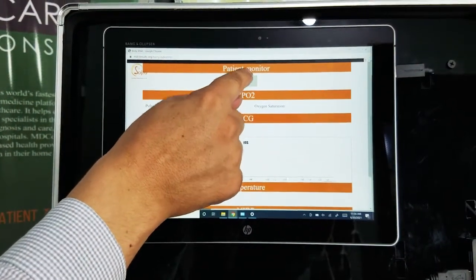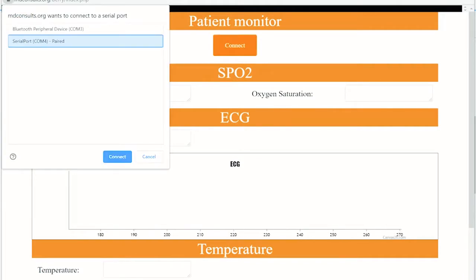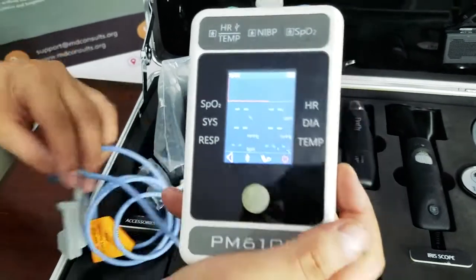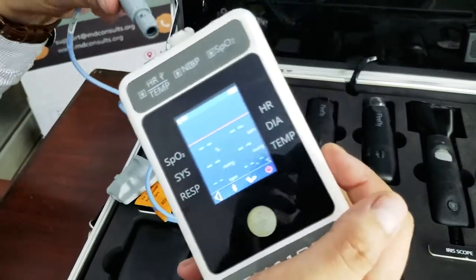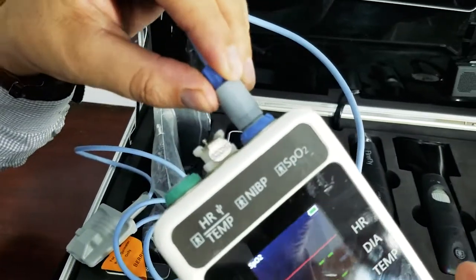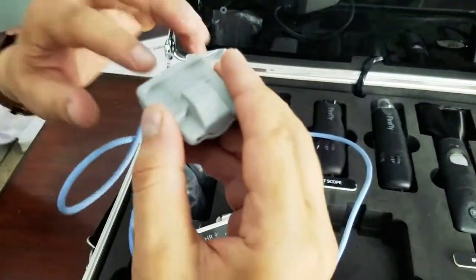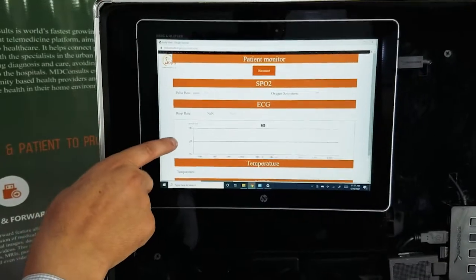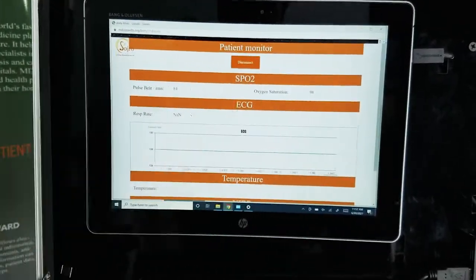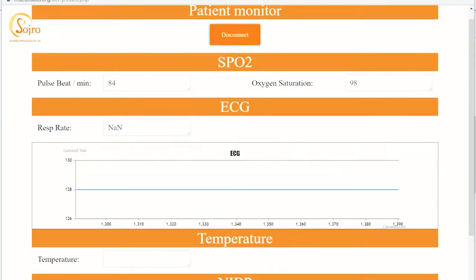You can turn it on, hook up the power bank, and connect the probe for the pulse oximeter. It gives you a number of different measures, which include your pulse rate and your SpO2.